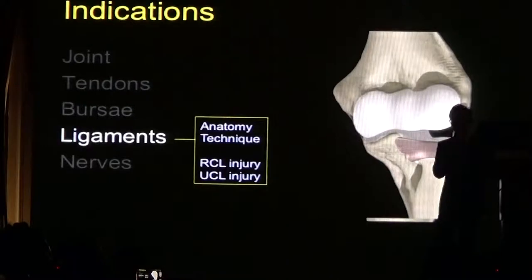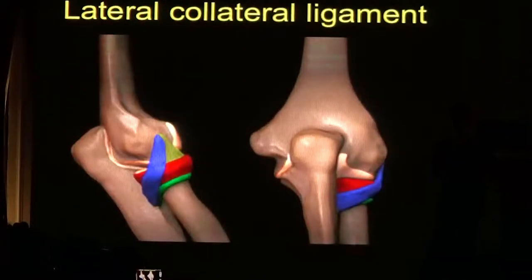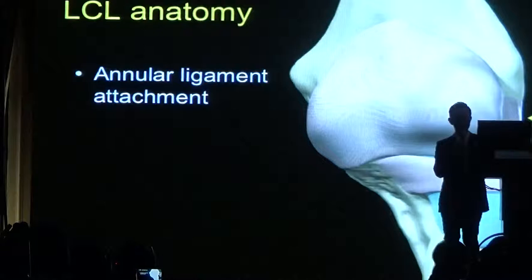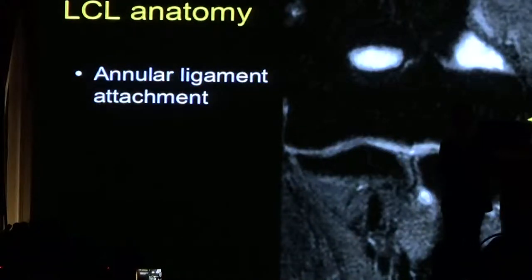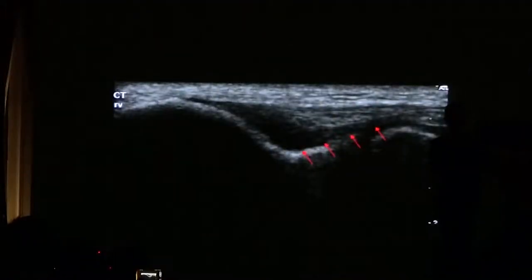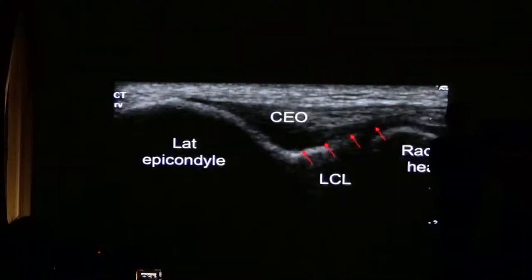Moving on to the ligaments — injuries of the radial collateral ligament and the ulnar collateral ligament are important to detect on ultrasound examination. The lateral collateral ligament, also called the radial collateral ligament, is a complex structure with three main components: the radial collateral ligament, the lateral ulnar collateral ligament, and the annular ligament. The radial collateral ligament attaches to the annular ligament. On MRI, you can see it extending deep to the common extensor origin, and on ultrasound the appearance is similar.